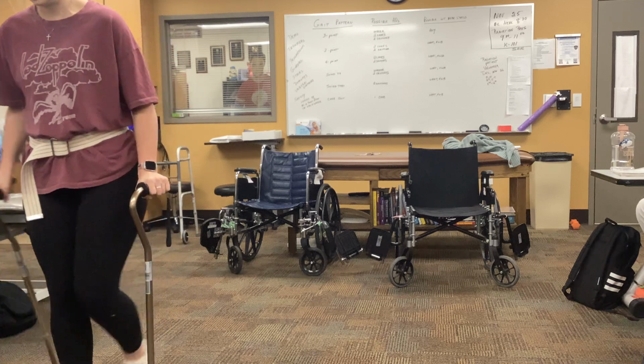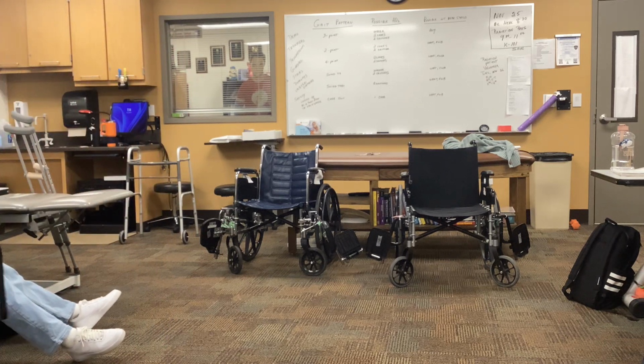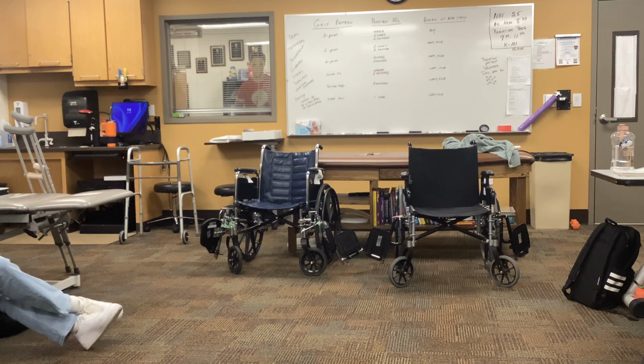And she's still looking down, so remember, your patients are looking down because it's the first time they have to figure out where their feet and their assistive devices are, but don't forget to look up where you're going. Okay, all right, so do a turn. And again, she's going to turn to whichever her dominant or stronger side is.